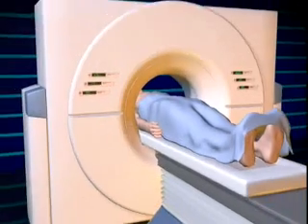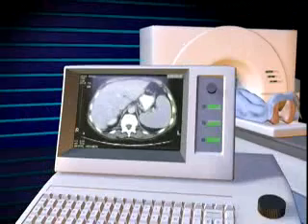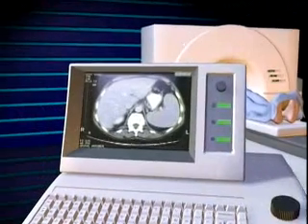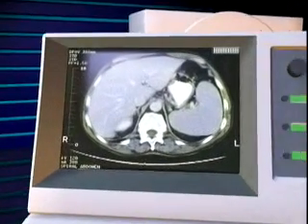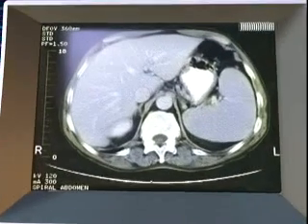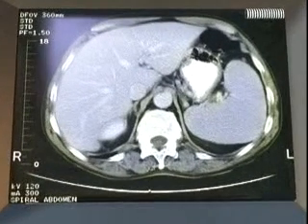A computer gathers, compiles, and translates these images into a 360-degree view of a targeted area, or even the entire body.